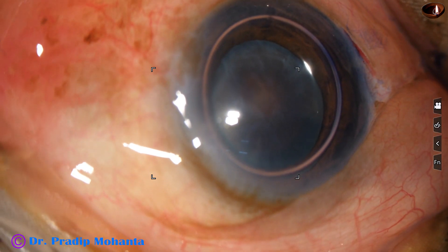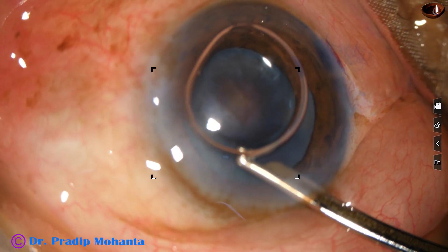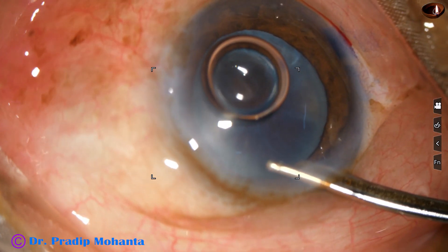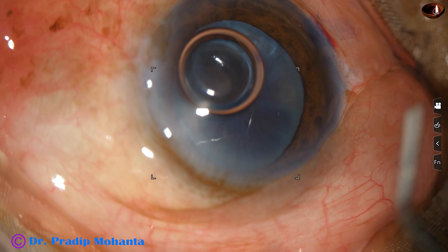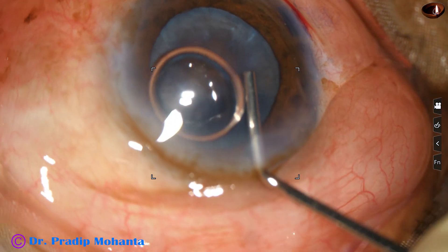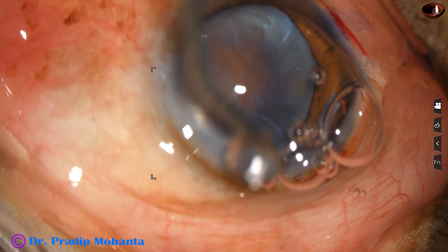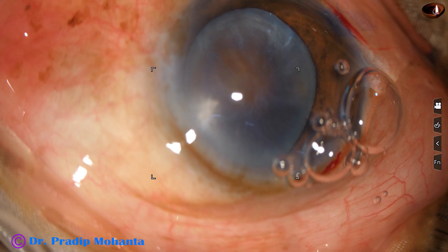I usually wash the dye — it looks clean. And now I inject 2% HPMC in the anterior chamber. HPMC is also applied over the corneal epithelium; it improves visibility.